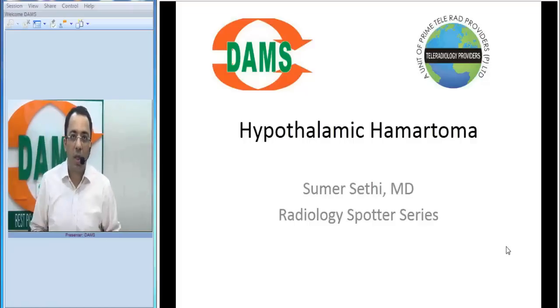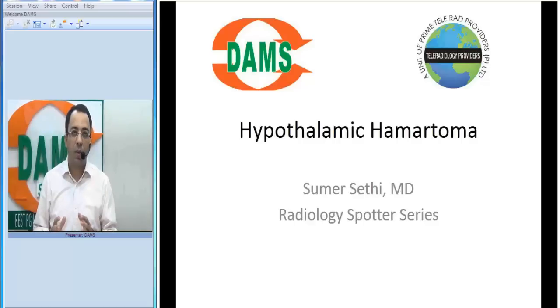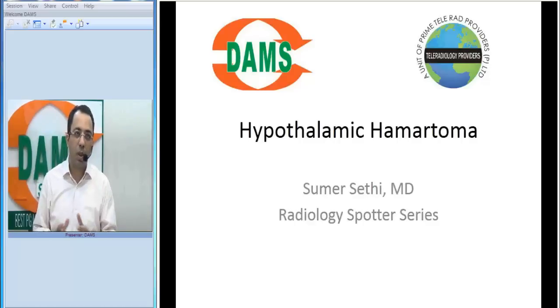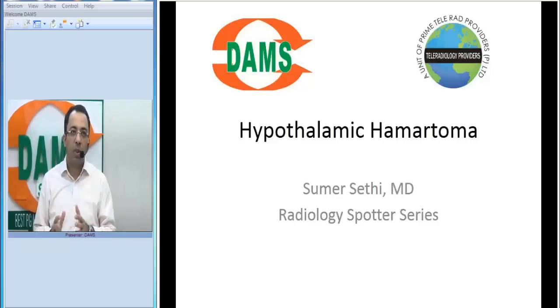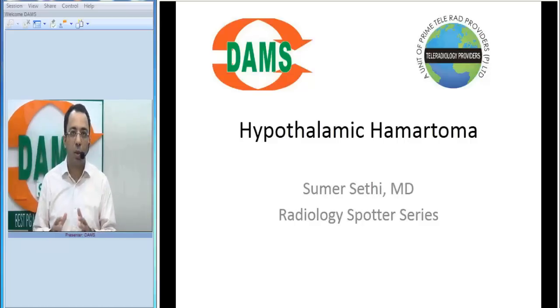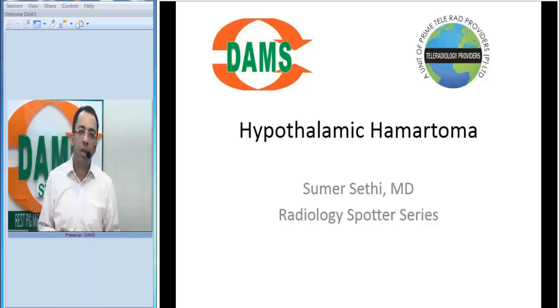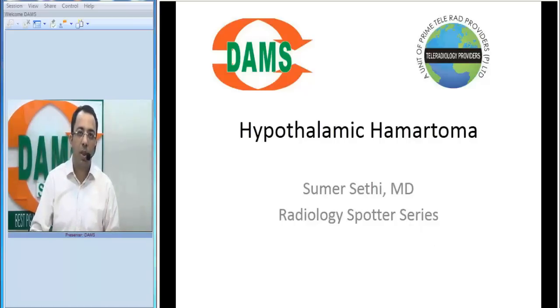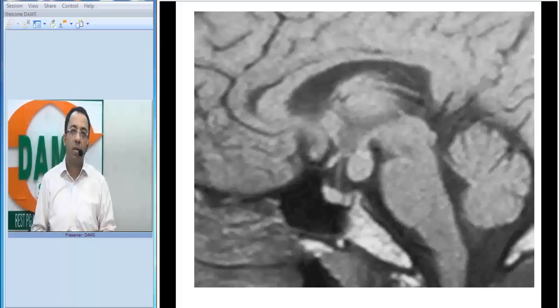In today's series we will look at another hamartomatous lesion of the brain — a very often asked spotter for radiology residents. We have called this series the Radiology Spotter Series, and we deal with cases which are easily diagnosable on imaging. So let us straight away jump to the image and see what the finding is.